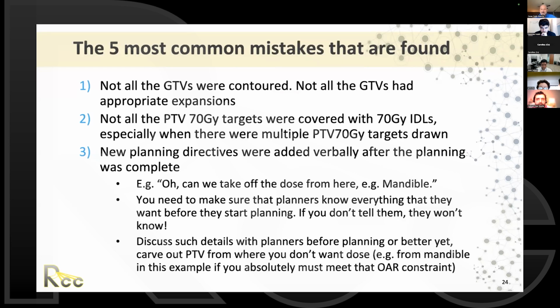But if you have something in mind that is particular for a case and is not on the standard, you need to tell them, because the planners will assume that we are doing a regular planning process.